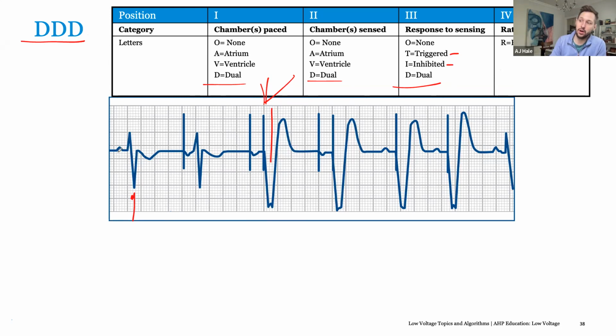So in this DDD mode, you have an atrial event occur. Now this is going to be an atrial-based timing. An atrial event occurs, it sets an AV delay, so it waits its 200 milliseconds, but before those 200 milliseconds come across, a ventricular event occurs. This resets the timer. It waits 1,000 milliseconds. An atrial event does not occur, so it paces here. AP, if anyone was wondering.